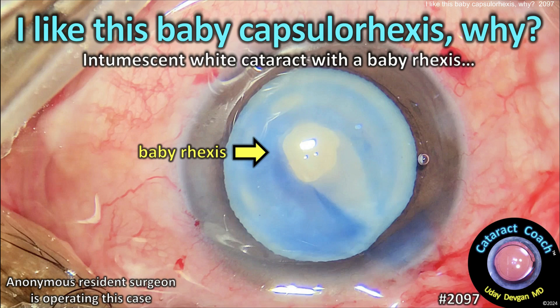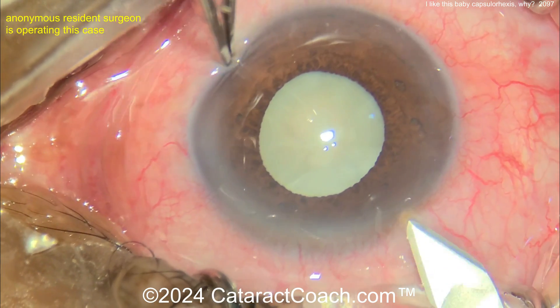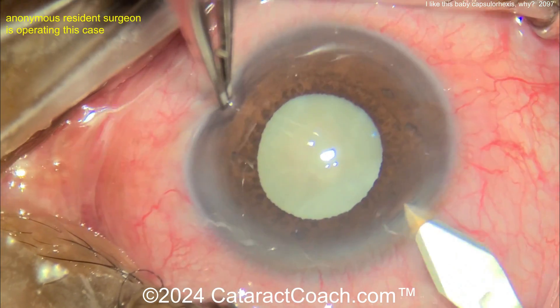cataractcoach.com. I like this baby capsulorrhexis, but why? Well, it's an intumescent white cataract with a baby rhexis, which as you know is going to be the double rhexis technique.